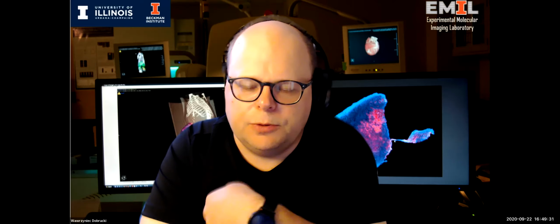Yeah, we want to increase the contrast on the image, right? For example, if you are doing CT imaging of a lung, the lungs have very low attenuation, so the X-rays pass through almost without losing energy.